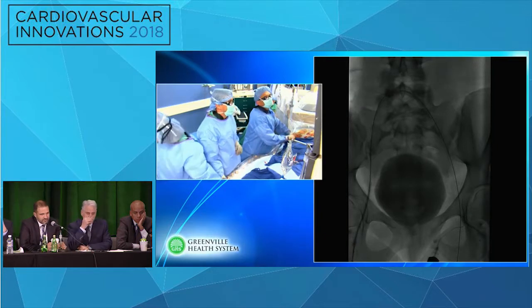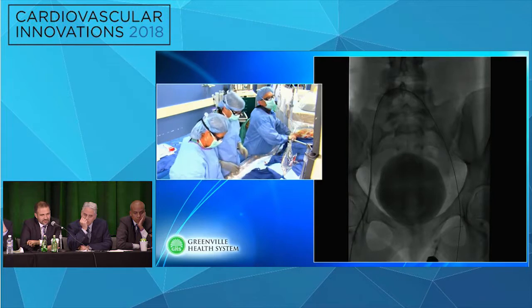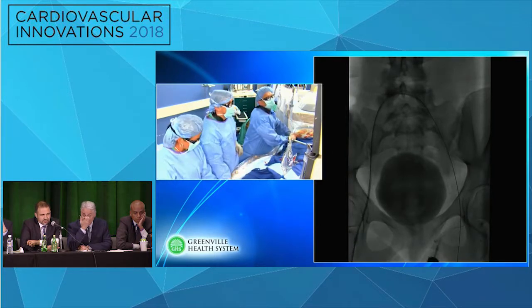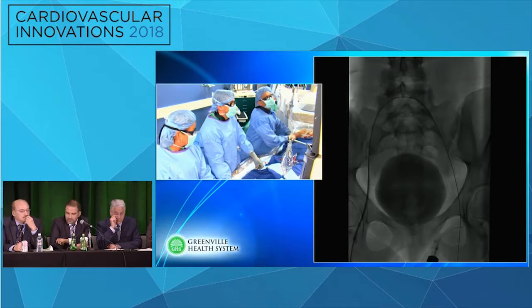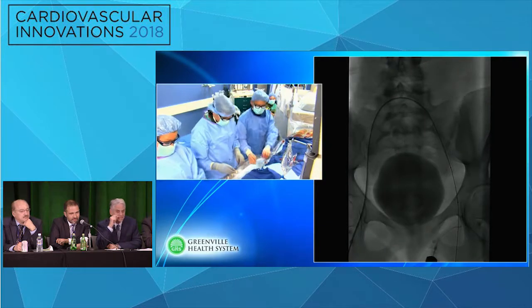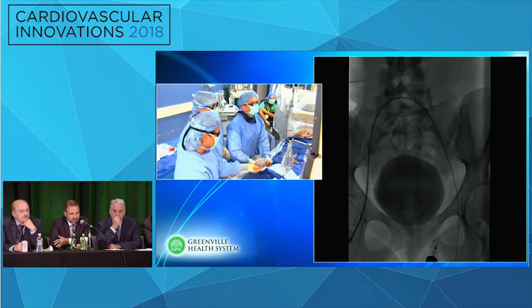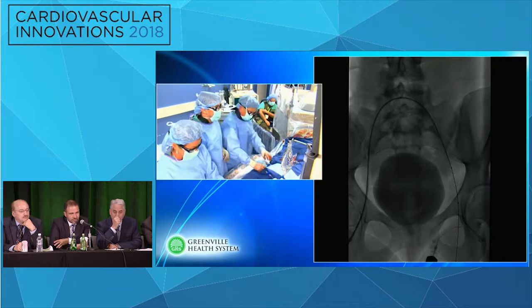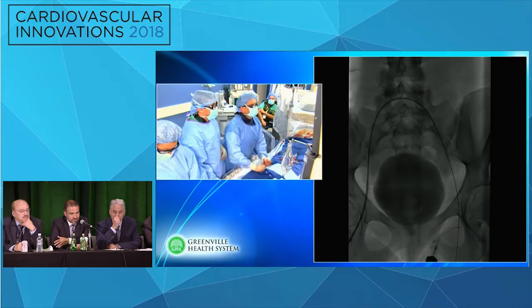No, I agree with everything they said, except the only thing I would add is that also the wall stent, the distal 1 centimeter to 2 centimeters is actually much weaker than the middle of the stent. So if you just try to be cute and land it at the bifurcation, you may not get the radial force that you need. So I think, as Kenny said and everybody else, that you have no choice but extending it. I mean, I think we don't have a good technology for this situation.